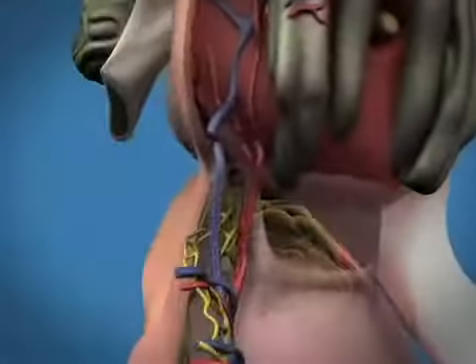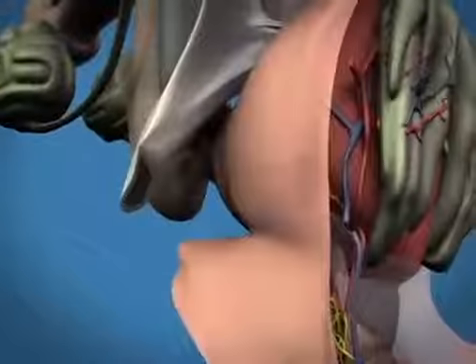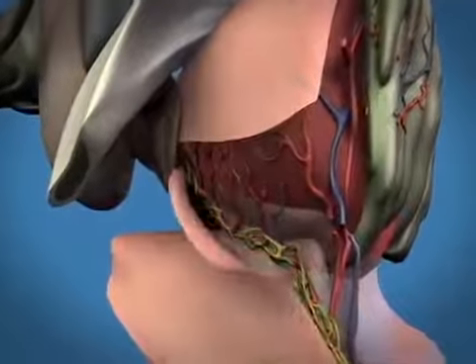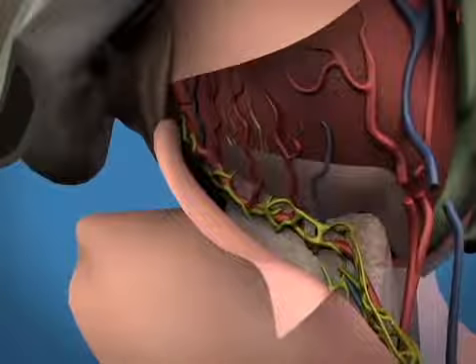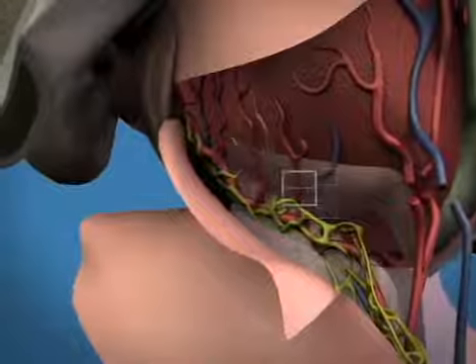Next, the prostate is retracted to one side and an incision is made in the levator fascia over the neurovascular bundle, exposing the neurovascular triangle. This provides an initial release of the neurovascular bundles. The neurovascular triangle is entered and the bundles are released by cutting close to the prostatic fascia, as blood vessels in this section are secured and cut.